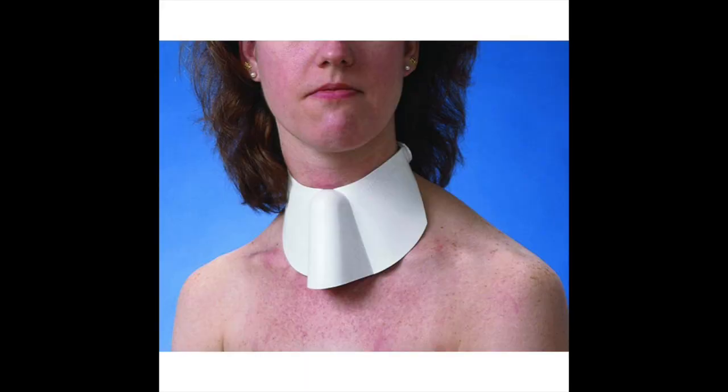Another option to prevent water from entering the airway is to use a shower shield. This will guard against water getting into the tracheostomy tube.